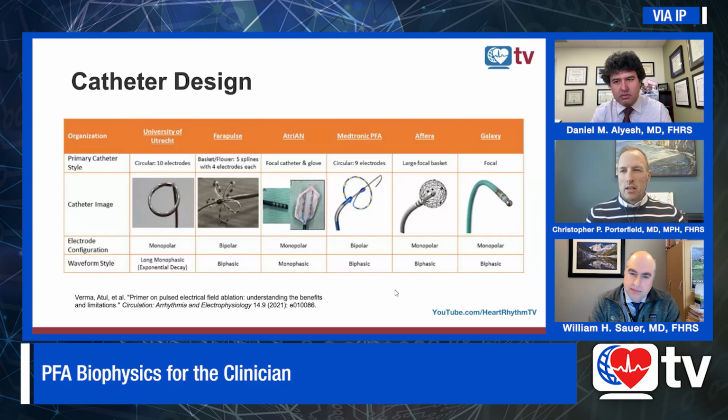All of these one-shot catheters are applying energy typically in a biphasic manner, looking at how far we can push the envelope efficiently with current to get enough of an injury to be permanently irreversible damage to the cells. So not all the catheters do it in the same way. Some are very efficient at delivering energy. Some are less efficient, more energy.